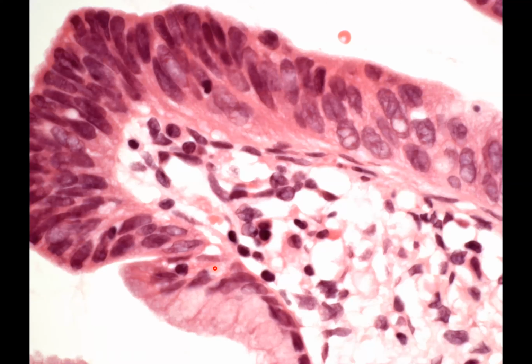So down here we have our normal endocervical cells, and remember I said the nuclei are in the basal third, and some of them can go a little higher, as you can see here, with a little plume or lovely columnar mucinous cytoplasm above. By comparison, in histology we often see this abrupt transition between normal and abnormal.